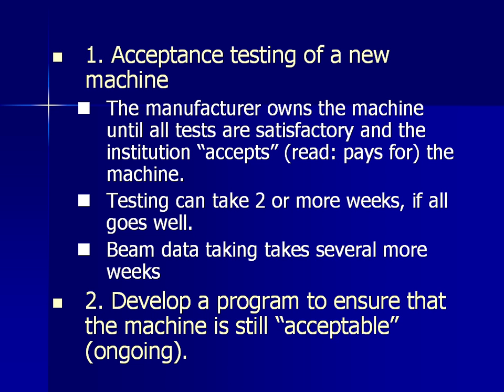Actually, the manufacturer won't calibrate the machine. Well, they have some rough equipment and they'll try and get it in the ballpark. And then our physics team would come in and calibrate it according to an AAPM protocol that's called TG51. In the old days, we kind of did it by hand, and you would see exactly how you're putting things into an equation. And you would have somebody double check everything. That's how I'm used to working.